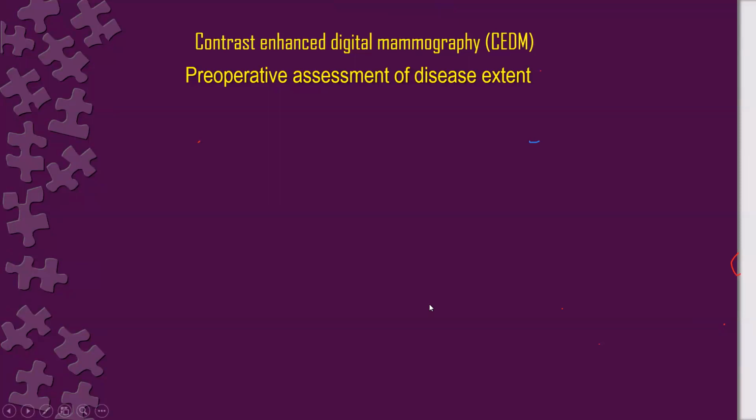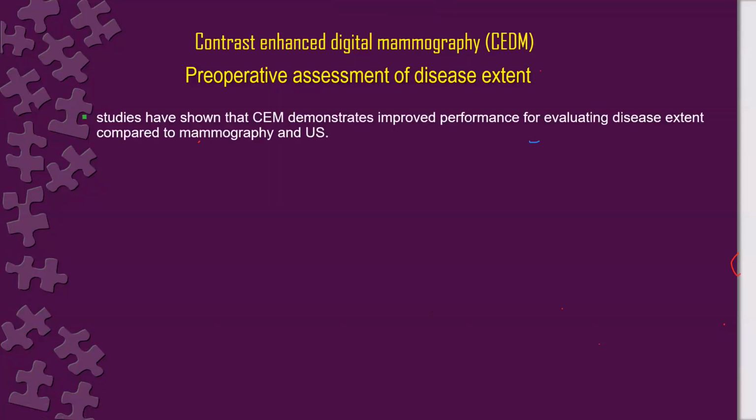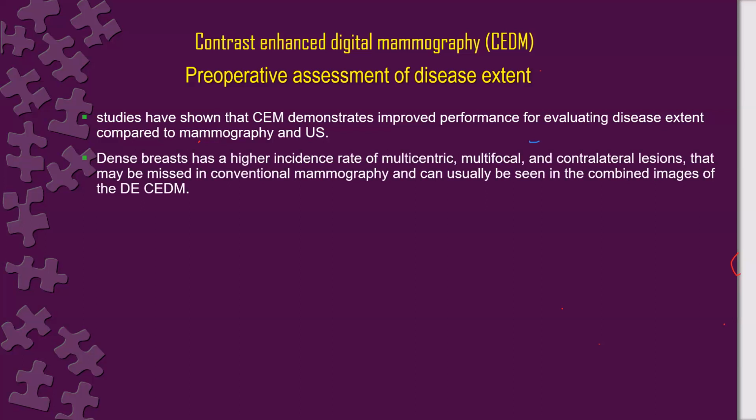So in preoperative assessment of disease extent, studies have shown that contrast enhancement demonstrates improved performance for evaluating disease extent compared to mammography and ultrasound.